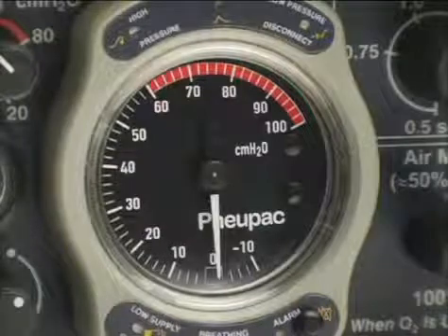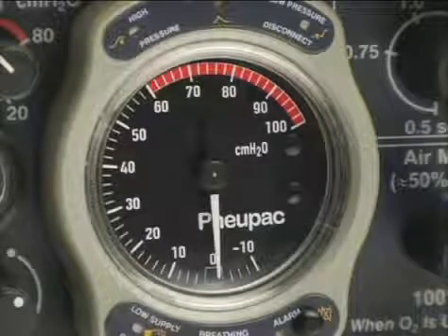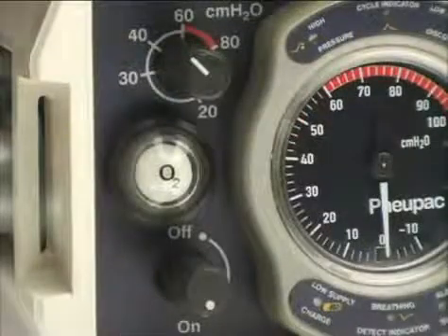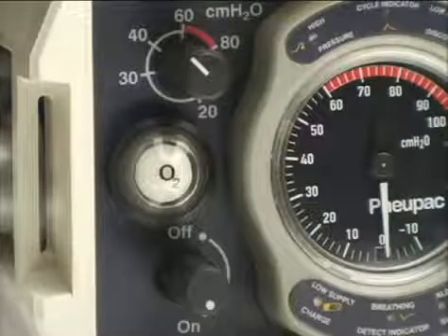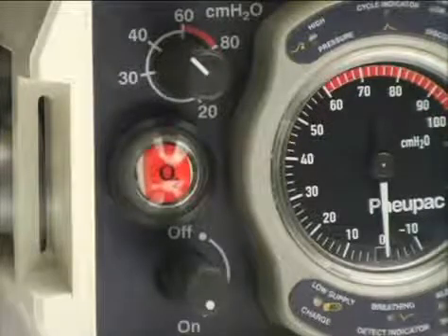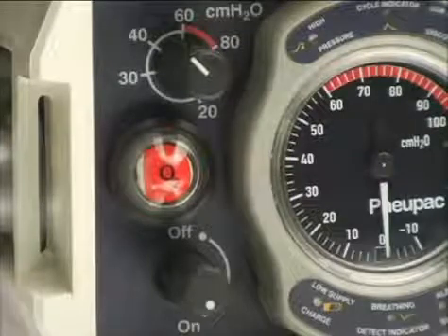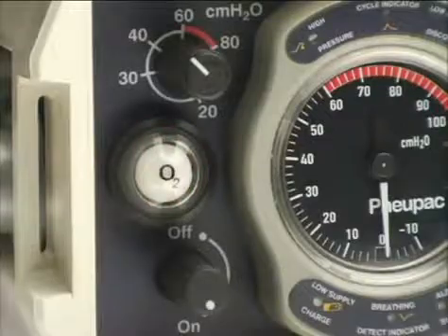This display accurately indicates actual patient proximal inflation pressure under all normal settings of the ventilator. Rely on this visual indicator to warn you when the supply gas drops to a pressure that prevents the ventilator from operating to specification. Low pressure turns the indicator red, with an accompanying electronically generated priority audible warning. Adequate pressure shows as white.